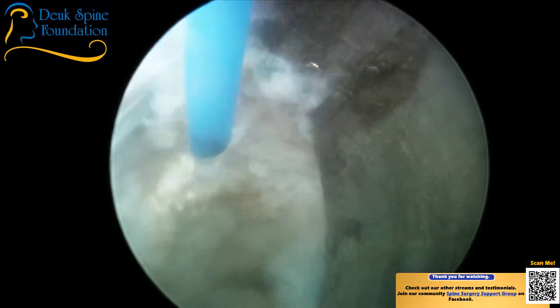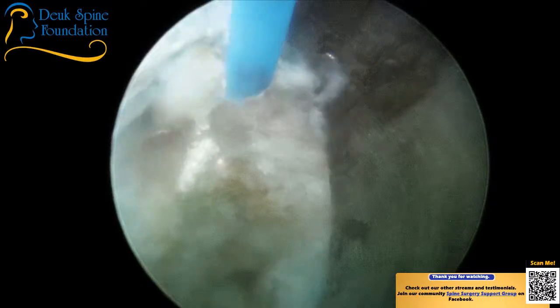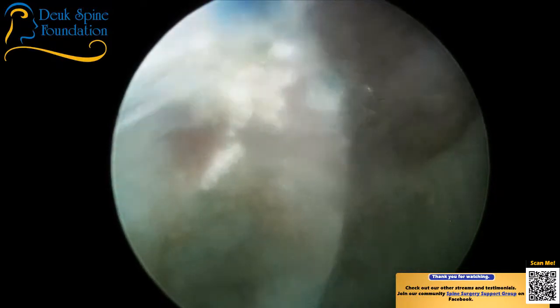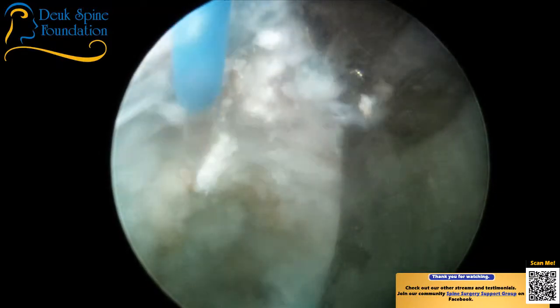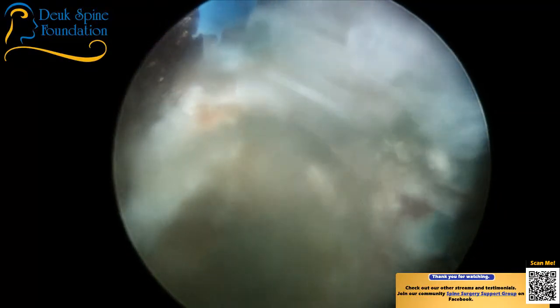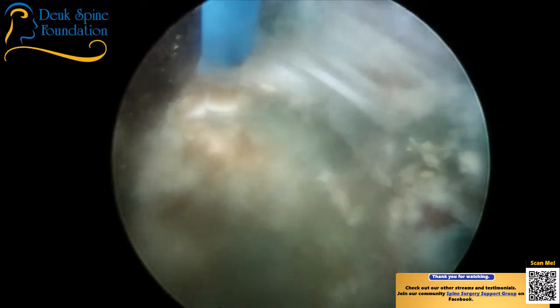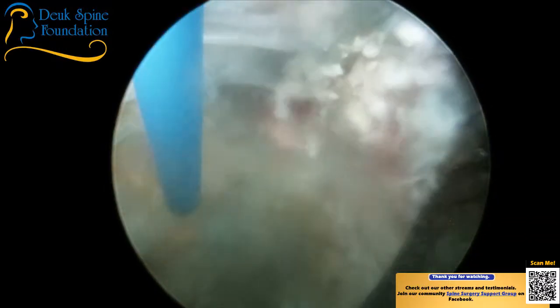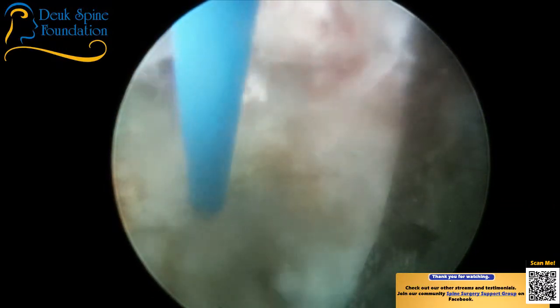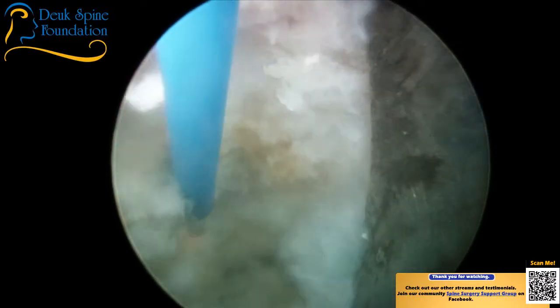The annulus has pretty much been ripped all the way through from the inside to the out. The herniation that we saw with our discogram is gone. That's a little bone spur calcium right there. I'm zapping away. It turns gold in color. Okay, so this is right where that herniation was. It's gone. So I shoved it into the disc, and I've been zapping away at it with a laser and just taking it apart little piece by piece. You can see it shriveling up with the laser.